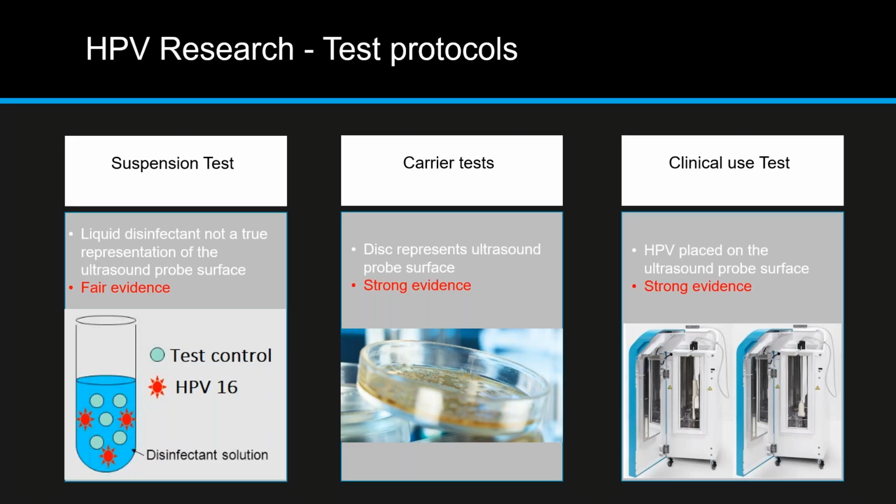So we know that the virus can be dried and recovered without any harm to the virus, but adding the disinfectant will then deactivate or kill the human papillomavirus, and our results will show that there's no or very little infectious virus left, and we can quantitatively measure that, and I'll show you that in a minute.